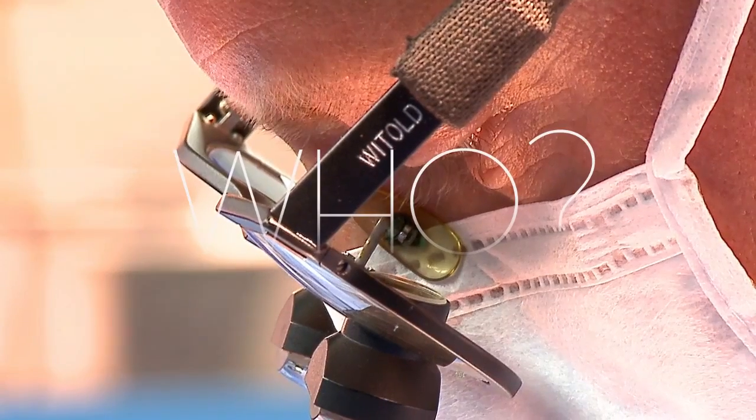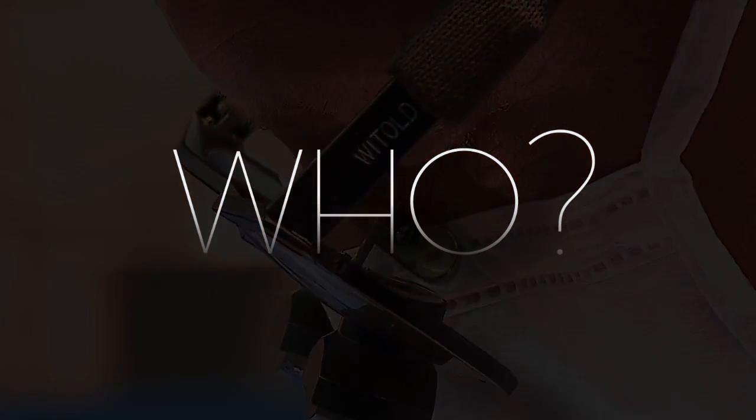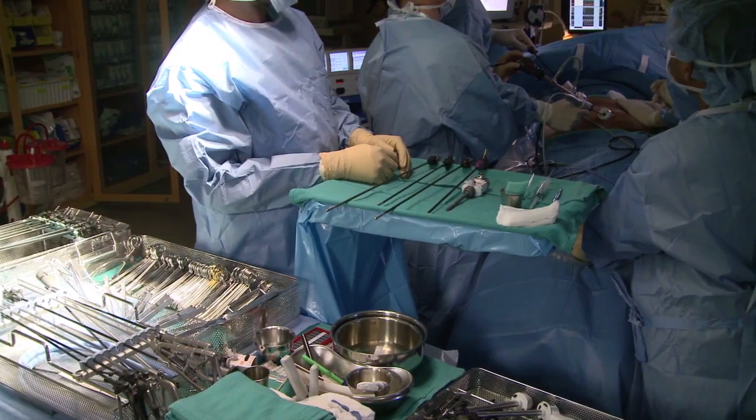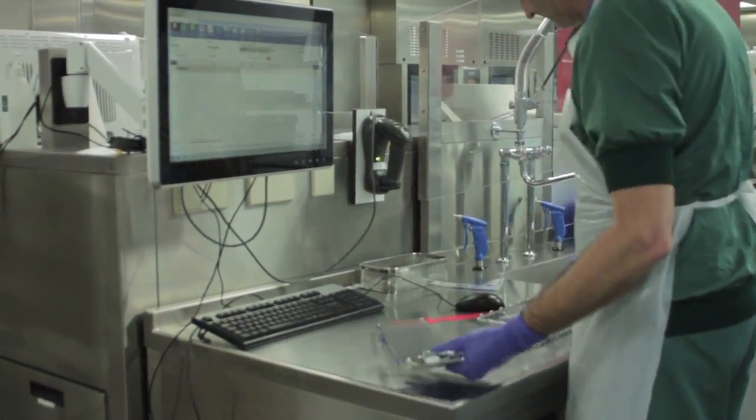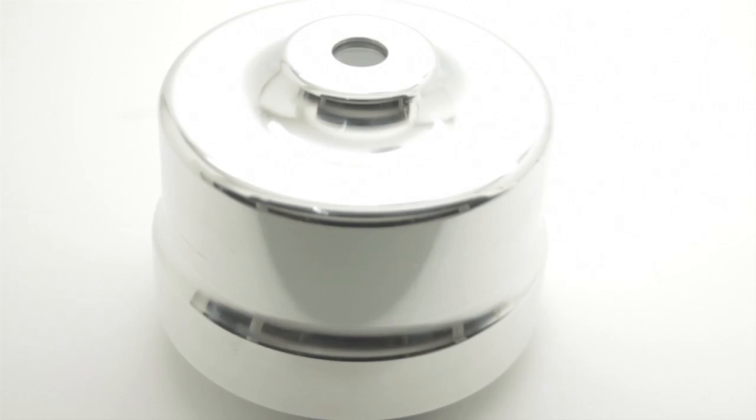Who else would provide you with such groundbreaking and innovative instrument management? No one. This is why Besco is the benchmark in sterilization management tools—the innovation in technology, the laser, the reader, the reports, the support, the training, the efficiency.